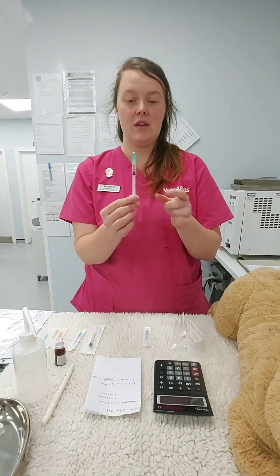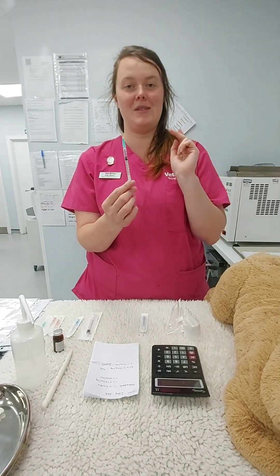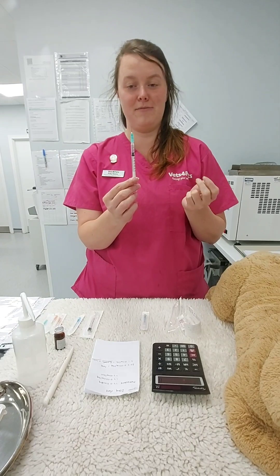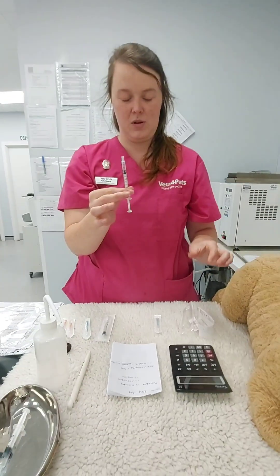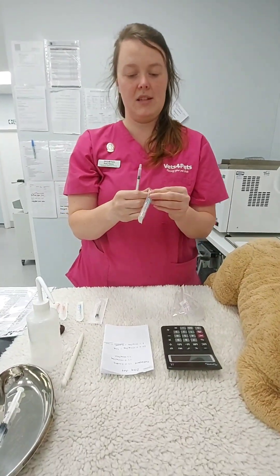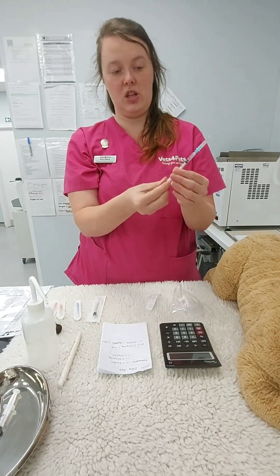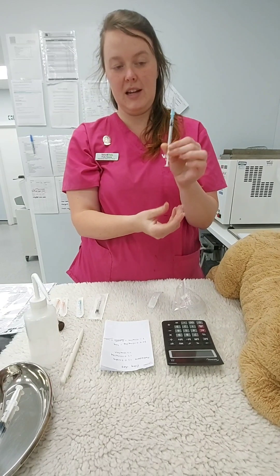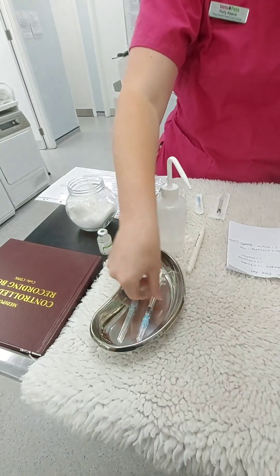You can use the lid of the sharps bin. I don't have artery forceps today, so I'll demonstrate the lid — but if you have artery forceps you can press them over and pull the needle off. Take the cap off the bin to leave a clean surface, then open your new needle accordingly. Place it on and push the plunger back up to the calculated quantity — 0.1 ml — and place it in the kidney dish for the examiner to check.